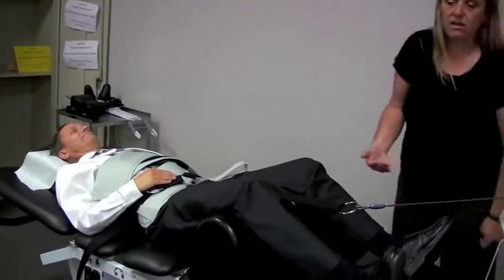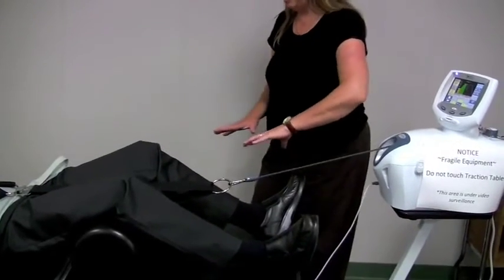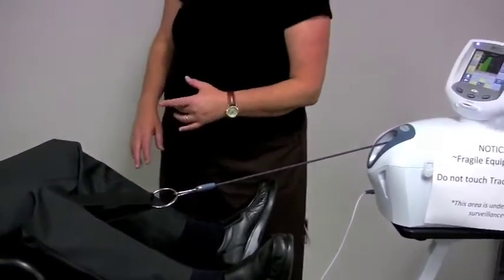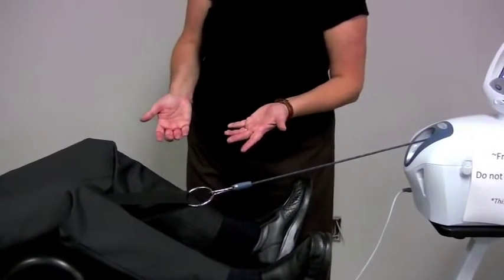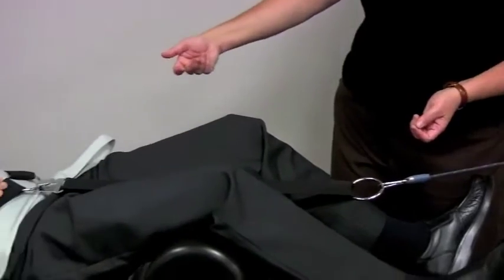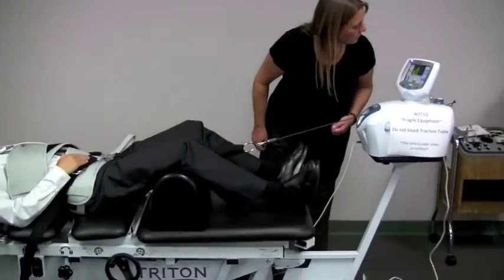And at the end of all of this, the whole table will slowly regress. The rope will release the tension. See how taut it is here? It'll release. That'll allow this table to roll back because it is on a spring. And I will want to do some important things at that point. Disconnecting everything, of course, and locking the table. And I will also want the patient to get up very slowly. So we'll just watch him finish this out here.